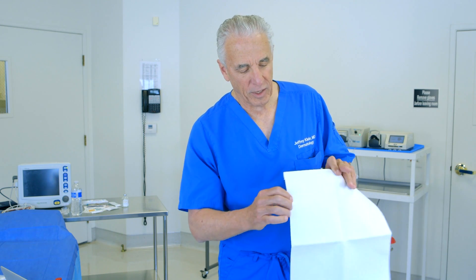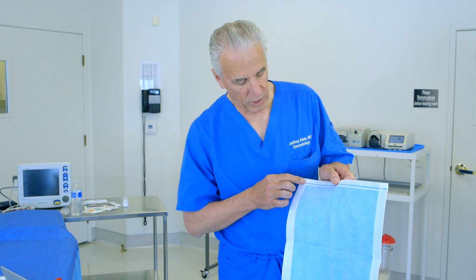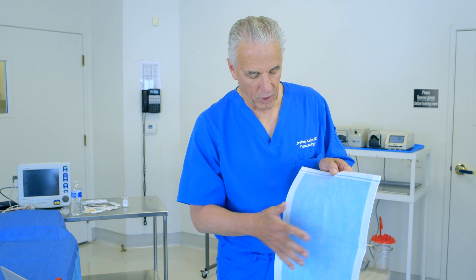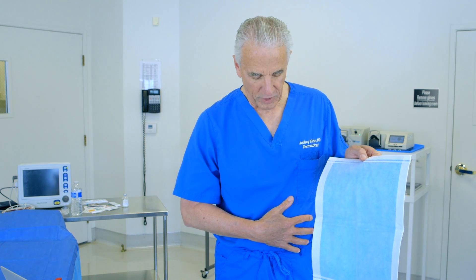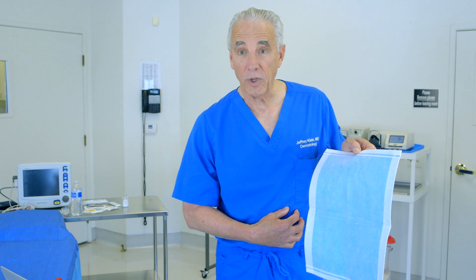The backing is impervious to water and it wraps around the margin here and is sealed, so that when fluid is absorbed after liposuction — for example, liposuction of the abdomen with open adits and drainage — a lot of fluid comes out.